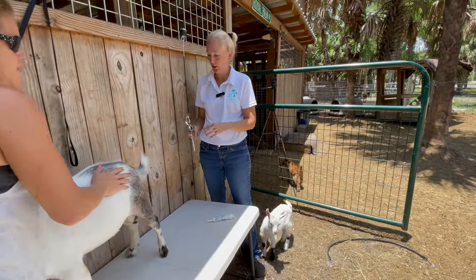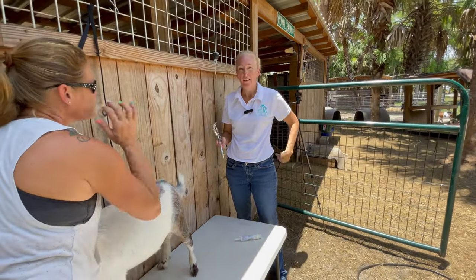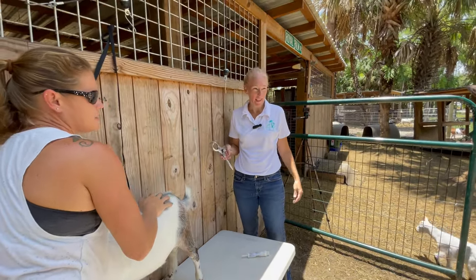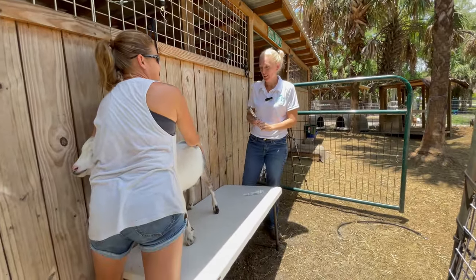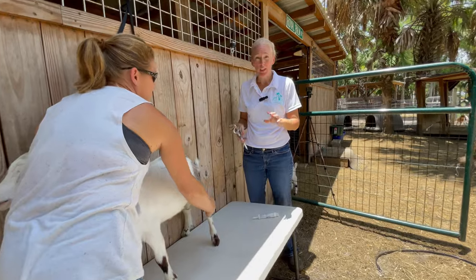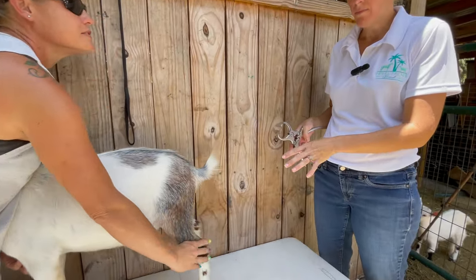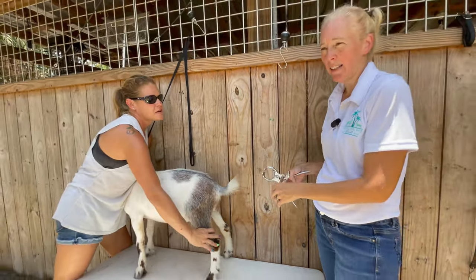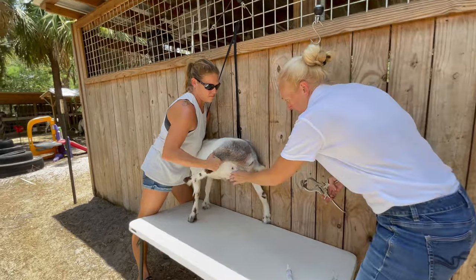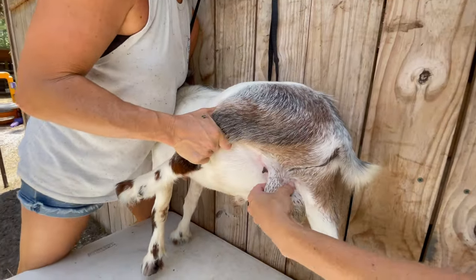We're back — we had a slight break because the goats tried to break into the feed shed, but crisis averted. We've done the left side, which we already showed. Now we're going to do the right side and then he'll be done. You can see our little indent there on the left side.